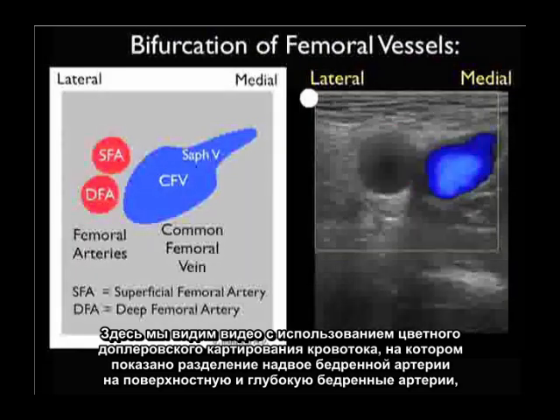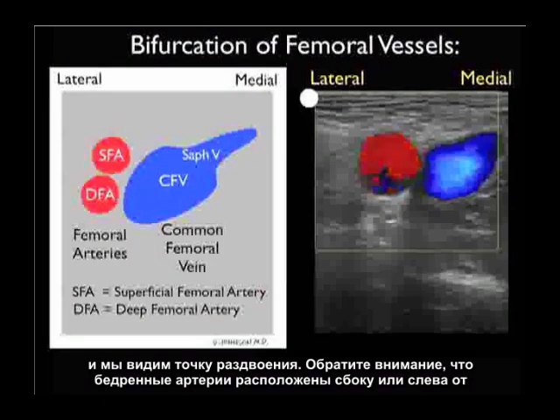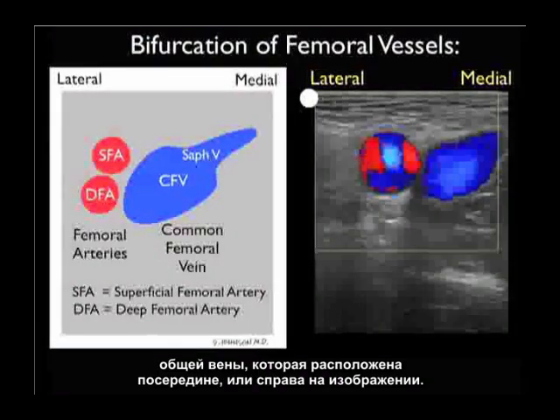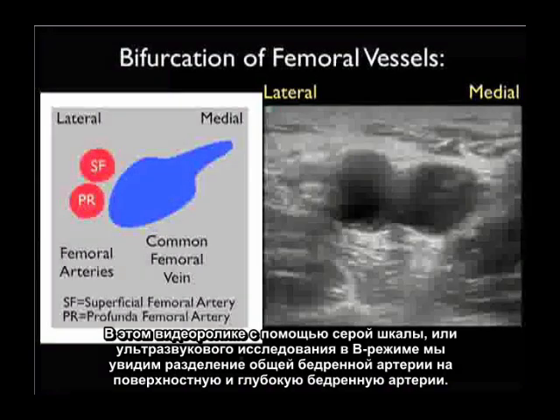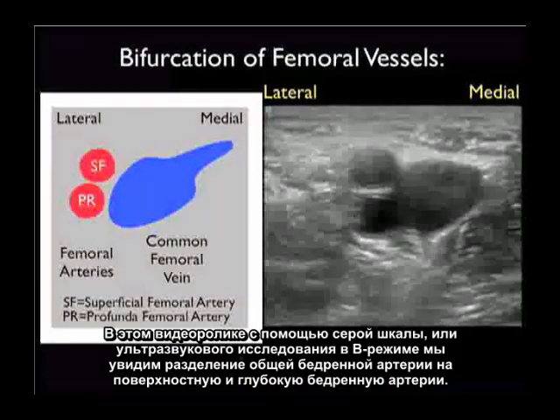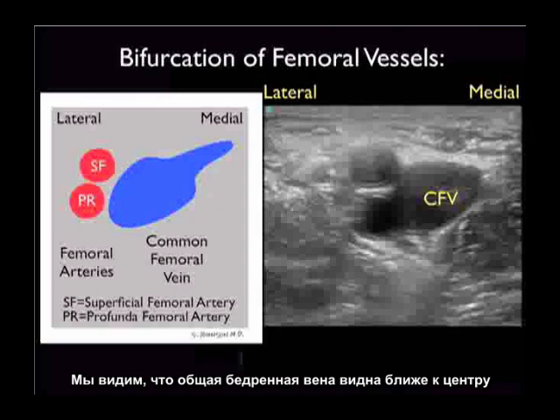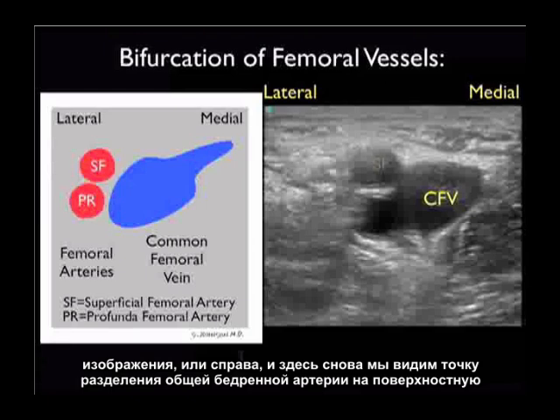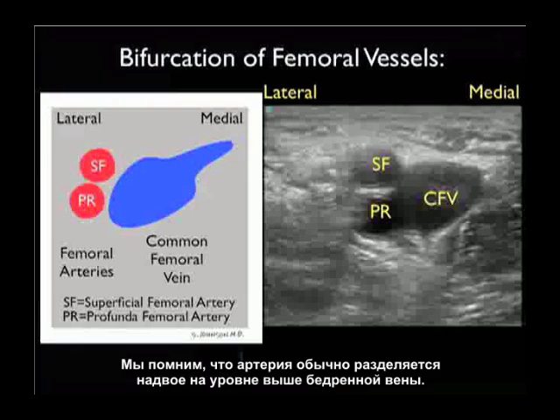Here we see a video clip using color flow Doppler demonstrating the bifurcation of the femoral artery into the superficial and deep femoral arteries. The femoral arteries are located laterally, towards the left of the common femoral vein which is seen medially. In B-mode sonography we can also note this bifurcation point of the common femoral artery into the superficial and profundus femoral arteries, remembering that the artery generally bifurcates at a level higher than the femoral vein.